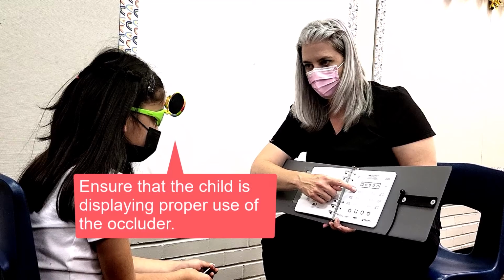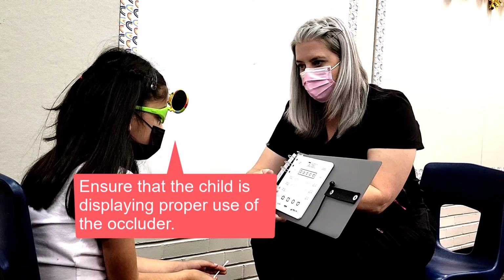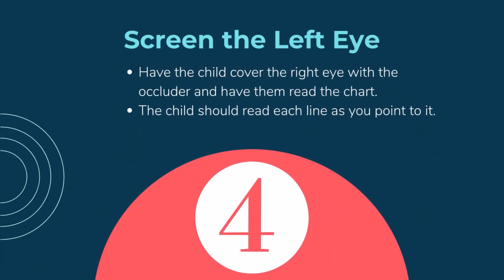Ensure that the eye is completely covered and that the child is not attempting to lean forward or peek around the occluder. If the child is having issues holding the occluder in a consistent or correct way, consider changing to a stick-on or flip-up glasses option. Repeat the process on the left eye.